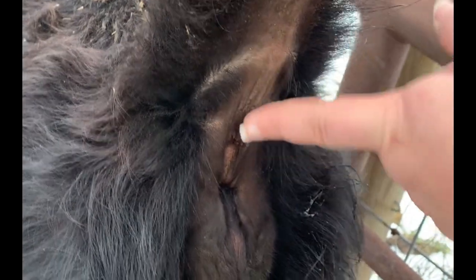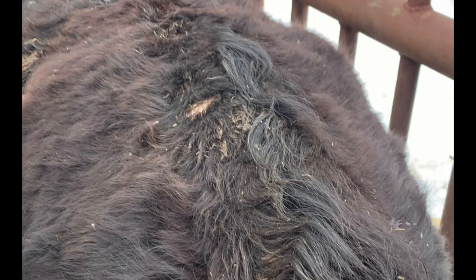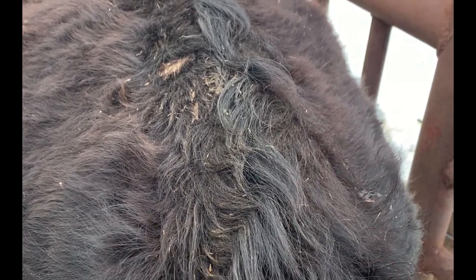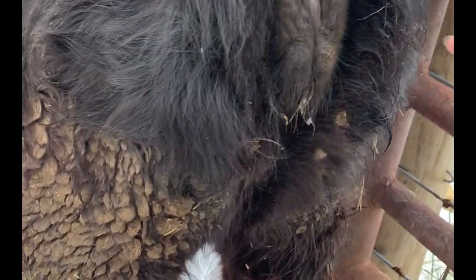We are going to draw blood here on her tail, about in that area right there. Now this is the best place to draw blood on cattle. I know I've seen videos where people get upset about drawing blood in the tail, but I've had this heifer for a while. I know she does not like her neck being poked, but she is a lot better with her tail — and like I said, it's also recommended. This is where you're supposed to do it, so she does a lot better with this.